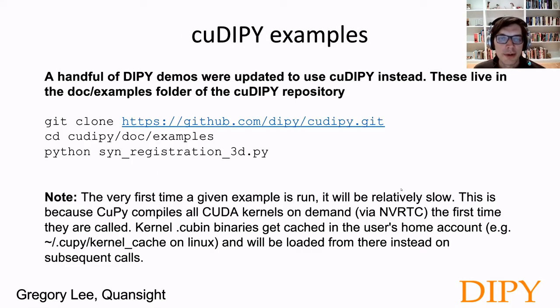So there are a handful of the demos I ported over from DIPY to cuDIPY, so those exist in an equivalent location. If you clone the main repository using git and navigate into the subfolder with the examples, you can just run any of those examples from the command line and they'll pop up the figures the same way it works for DIPY itself.